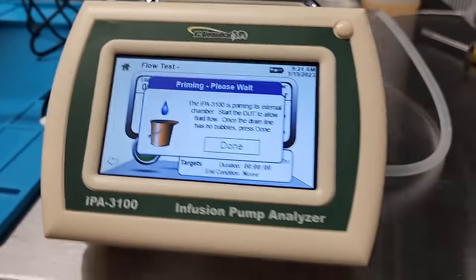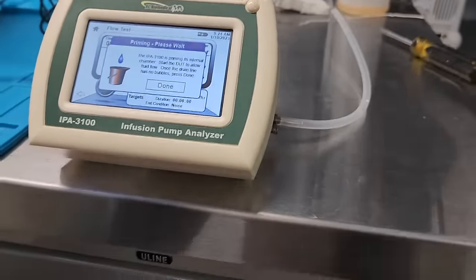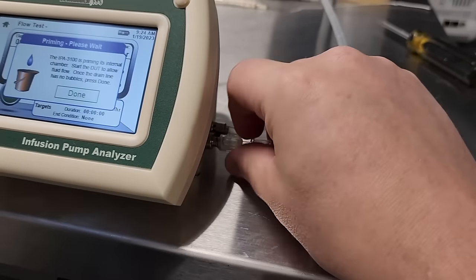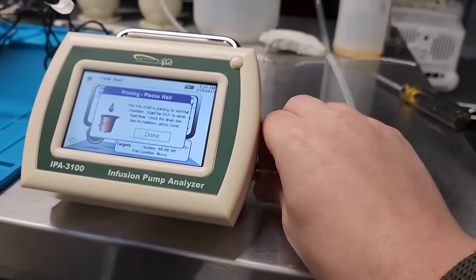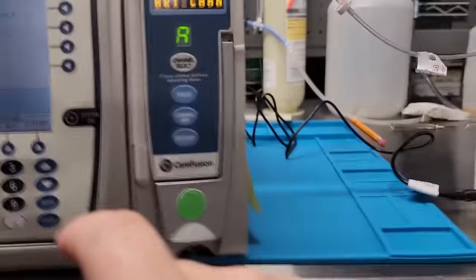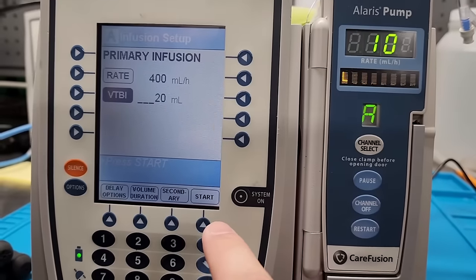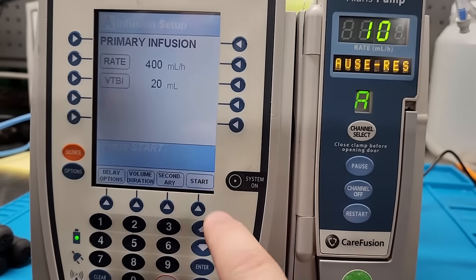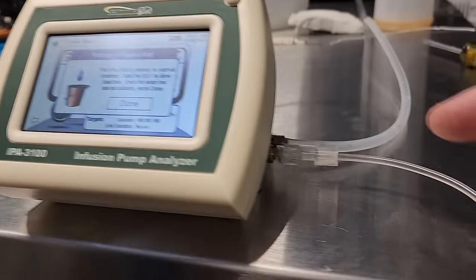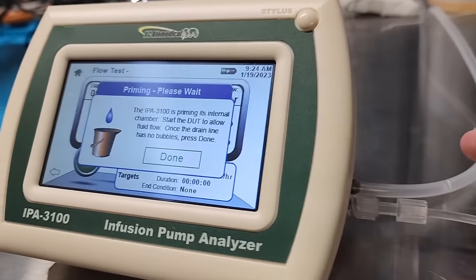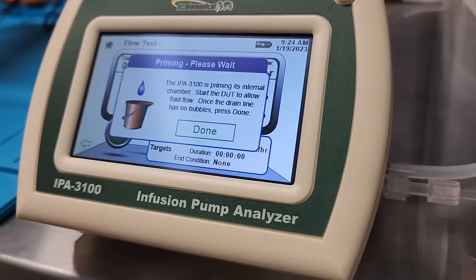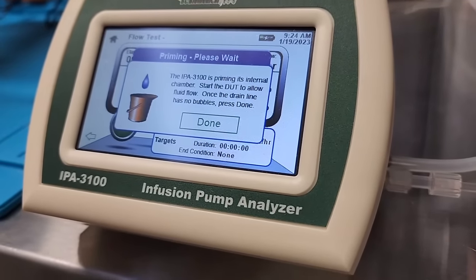It says it's going to prime, so let's go ahead and connect our infusion set right here. There we go. Luer locks. Drain tube is connected. So what it wants us to do is to prime it. We go ahead and hit start, and that shuts this guy up. Meanwhile, it says it's priming its internal chamber. Start the device under test to allow fluid flow. Once the drain line has no bubbles, press done.